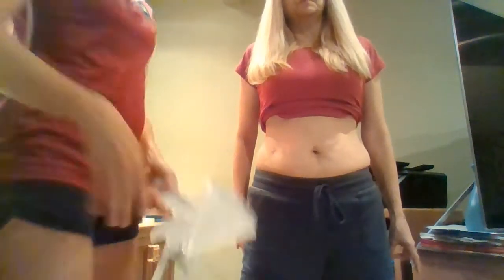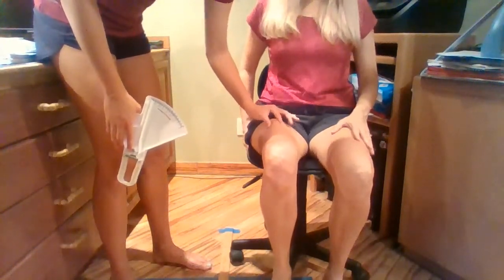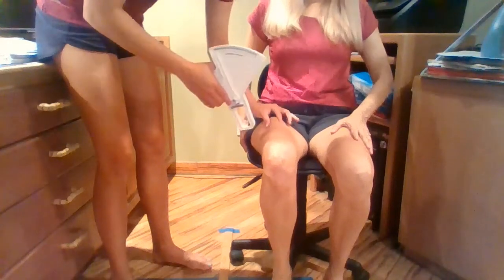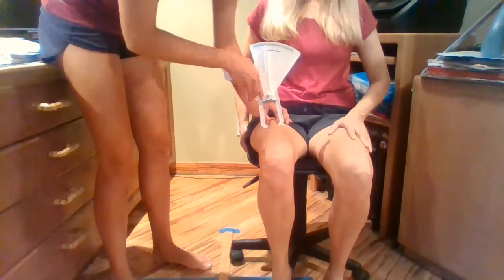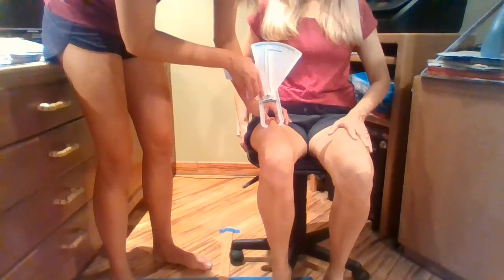And the last one is going to be the thigh, so go ahead and sit down again. And I am going to be grabbing the fat and not the muscle. Putting that right at the base of the fat. And this one is at 23 millimeters. All right, and that's our skin fold measurements.